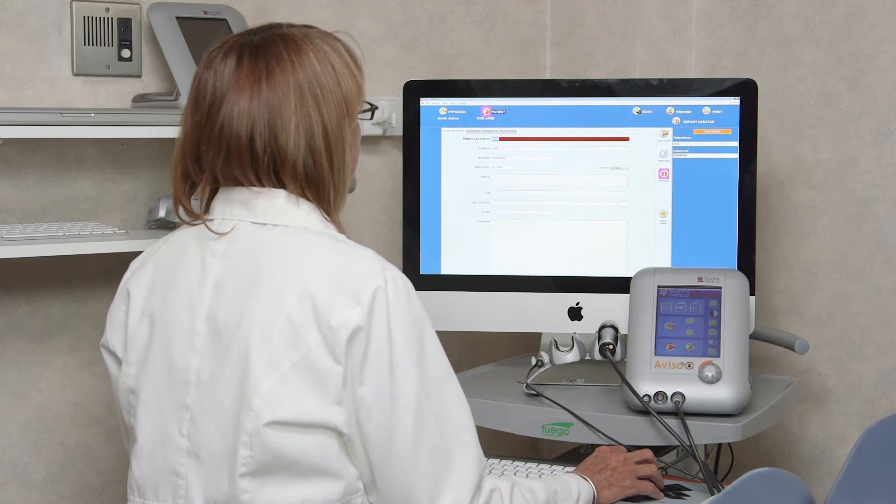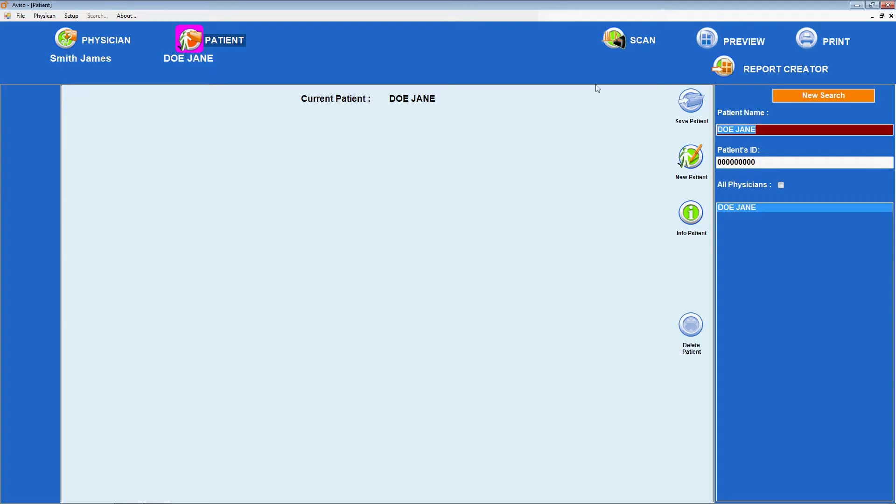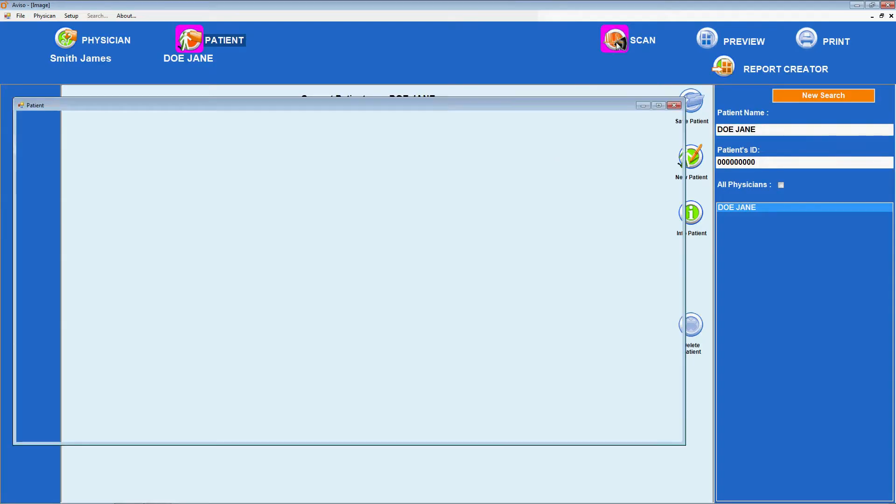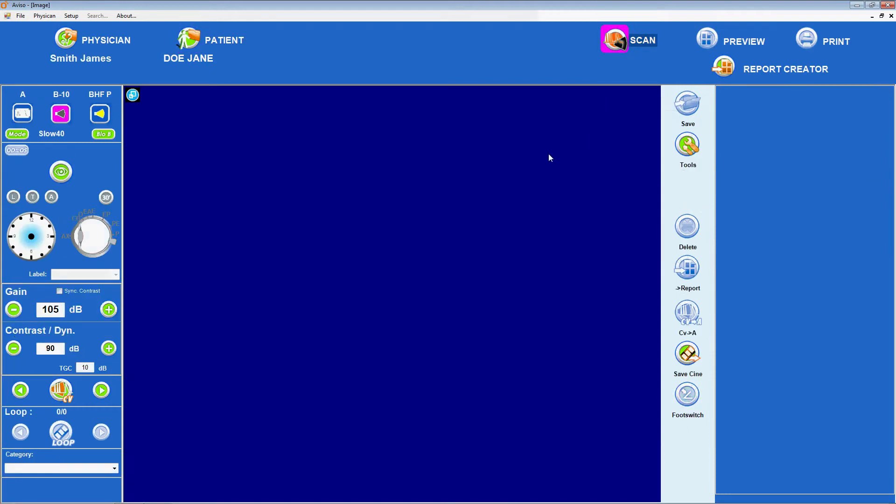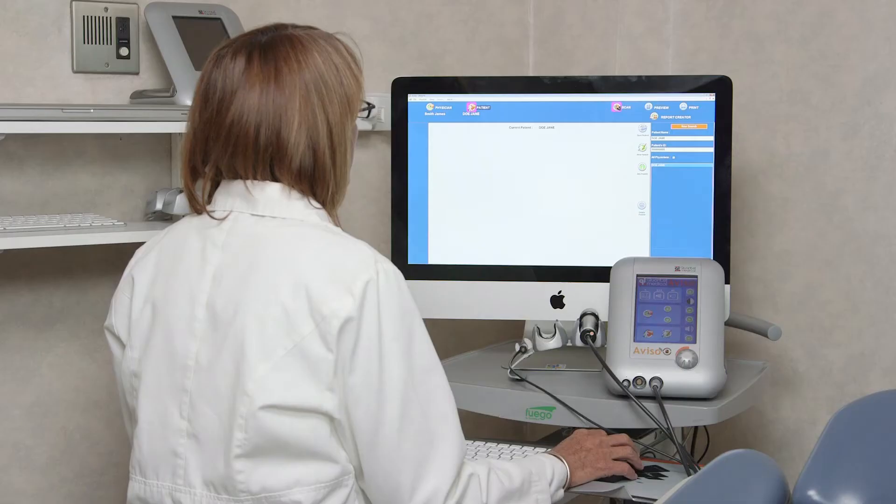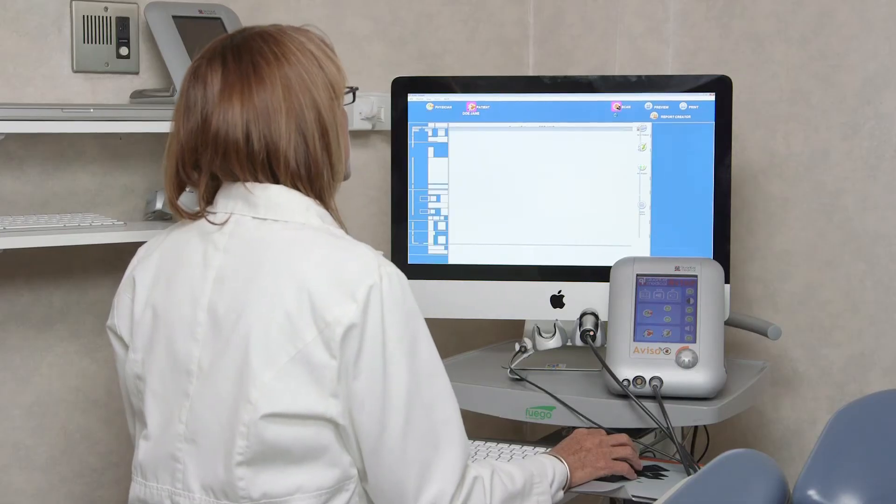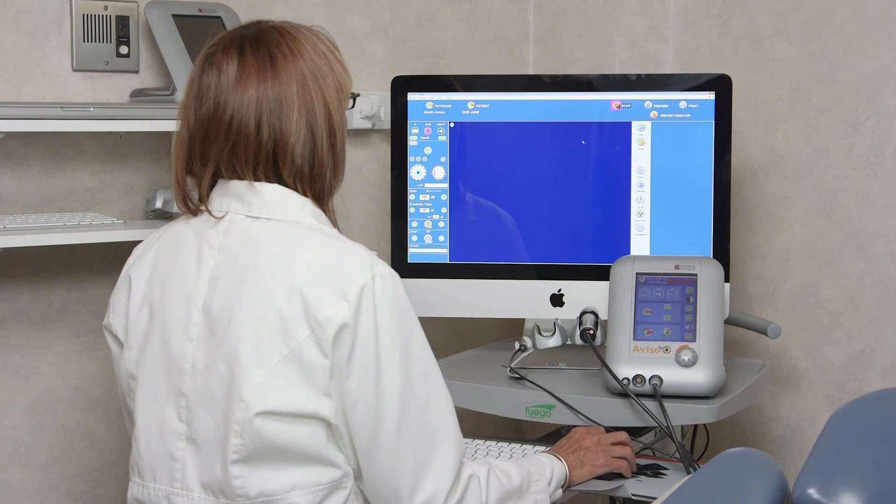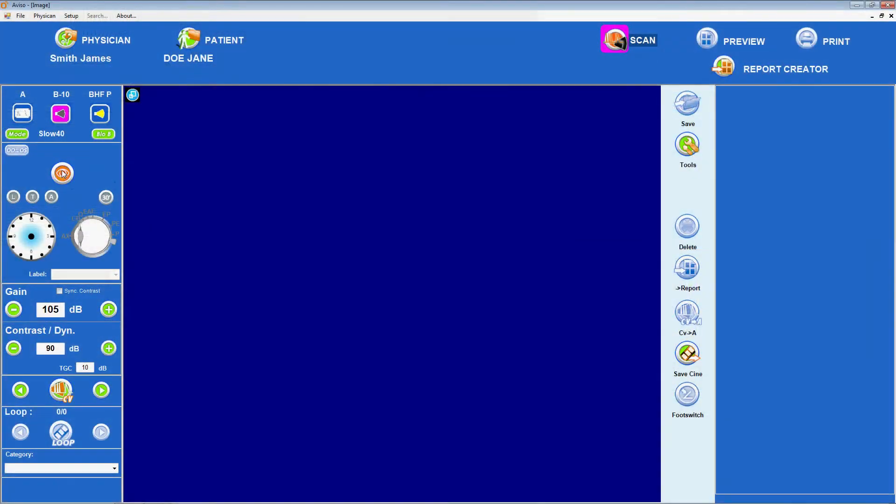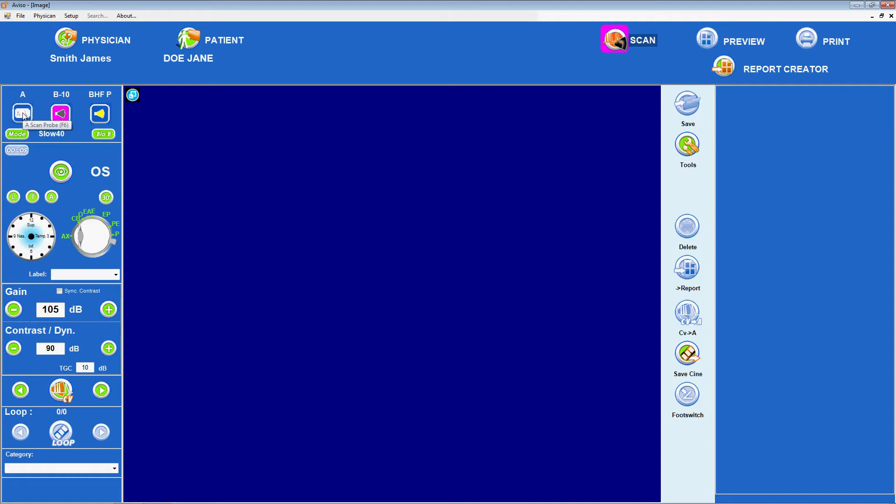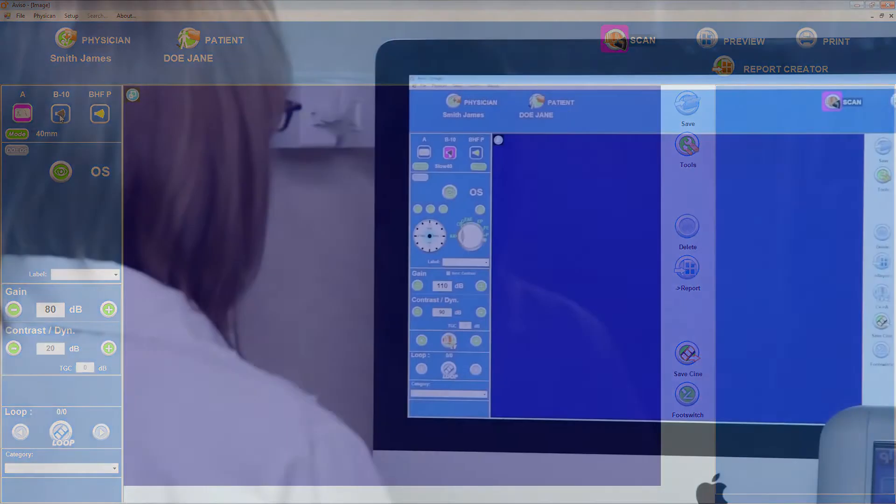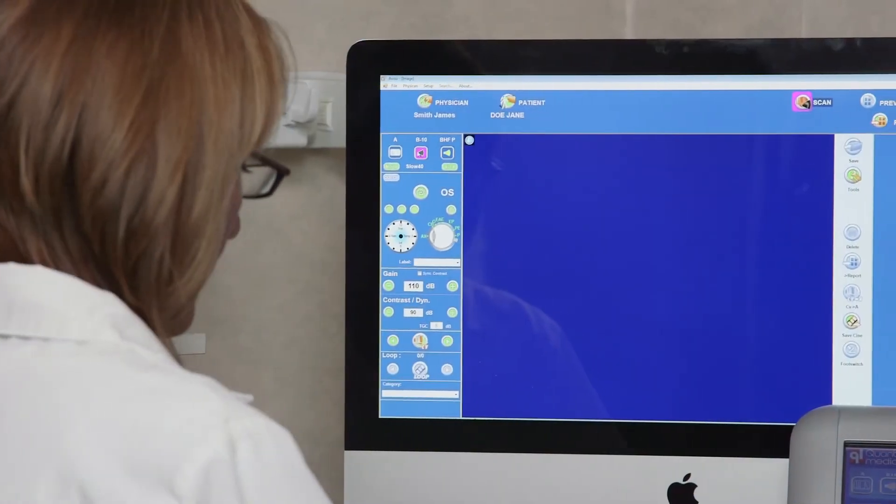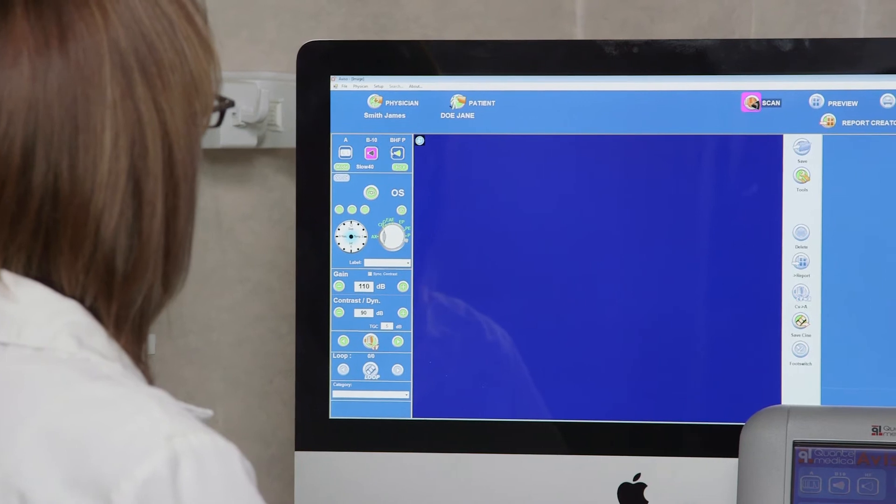Reports can be viewed by double-clicking. On the computer unit, clicking on the Scan icon opens the examination screens. Via this menu or the touch screen interface, prepare for a scan by first selecting the eye to be examined using the eye icon, OS or OD. Then, select the ultrasound technique using one of the three icons, A, B10 or BHF, toggling through until the correct probe is displayed.